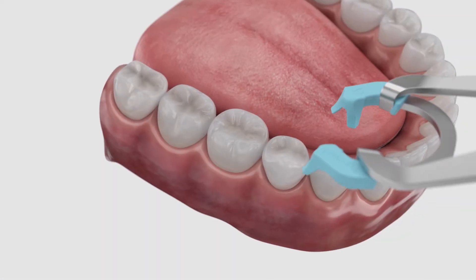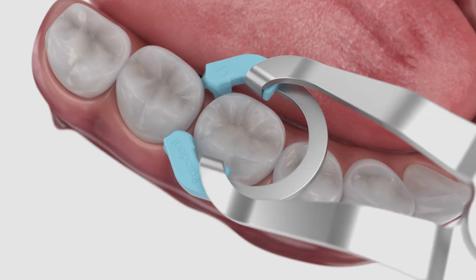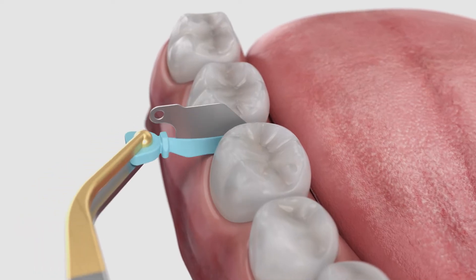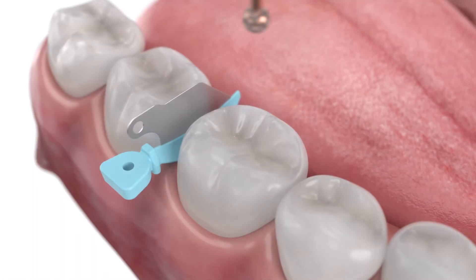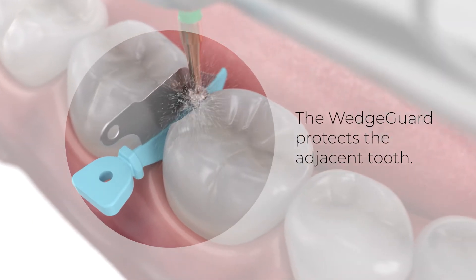First, if needed, place the appropriate Paladin V3 ring prior to cavity preparation to provide the necessary separation. Select the appropriately sized Wedge Guard and place interproximally. The Wedge Guard will help to protect the adjacent tooth during prep.